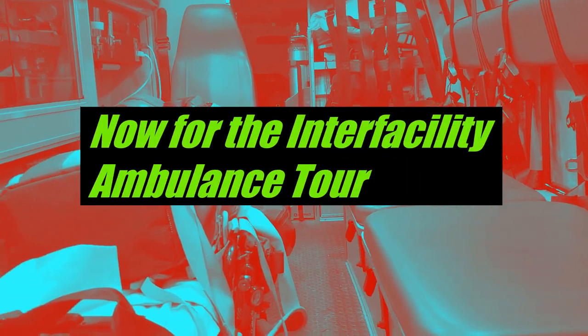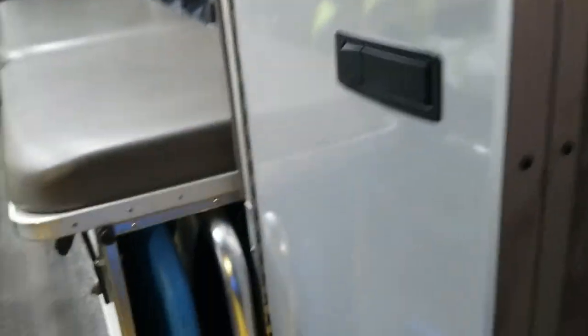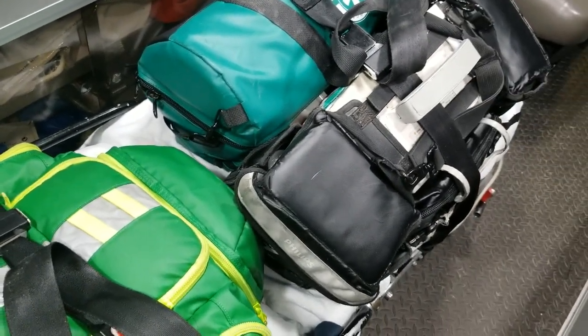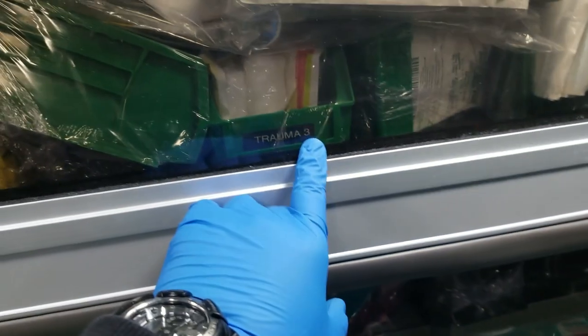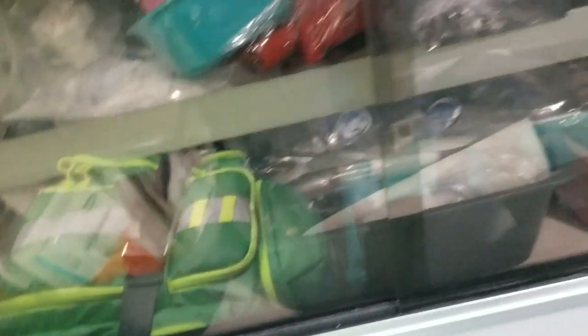This inter-facility ambulance is set up very differently — it's much more narrow — but we have the same or almost the same equipment inside. Check the main O2 tank at the beginning of the tour. We have mobilization equipment, splints, and a stair chair. The equipment inside is stocked the same way as the 911 system. The cabinets are the same. This one isn't as organized but everything is labeled and segregated the same way — BLS stuff up top and ALS stuff down below.